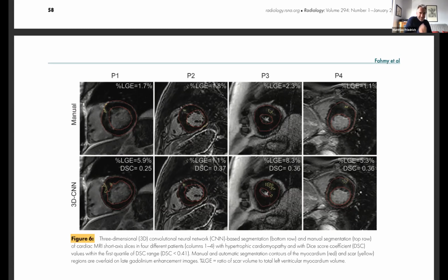Sorry to interject here. Yeah. So I think the evaluation of the uncertainty is important. Using the three different segmentations for the sliding window to measure this uncertainty, it could be used. But we can also, and we did this, but we did not present it, we can disturb the location of the slice, like doing shift or rotation of the input slice and get different segmentation and assess the uncertainty based on the variation in the results. This would give us a measure of the uncertainty in our algorithm, which overall we can evaluate by other metrics like the correlation coefficient or the dice index.